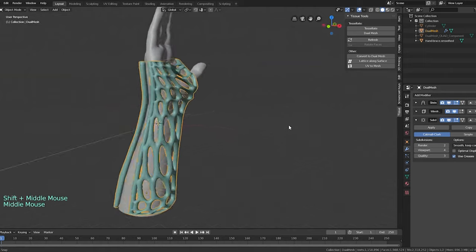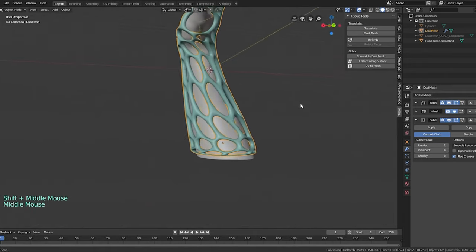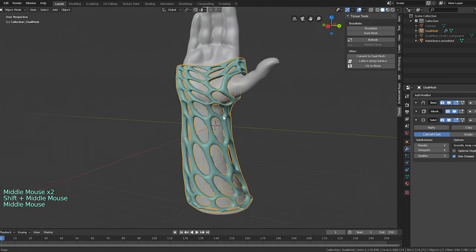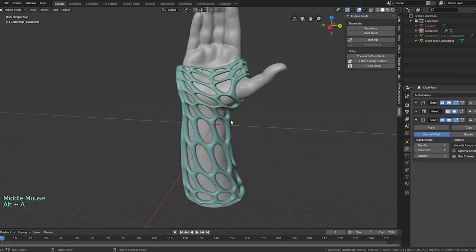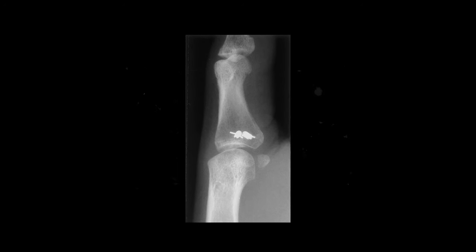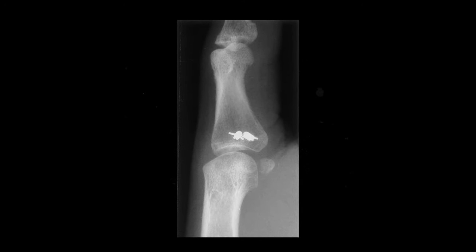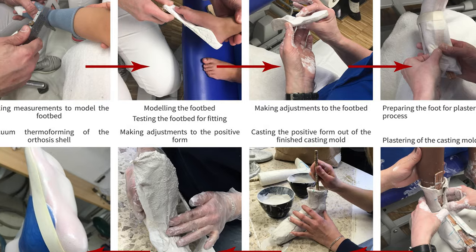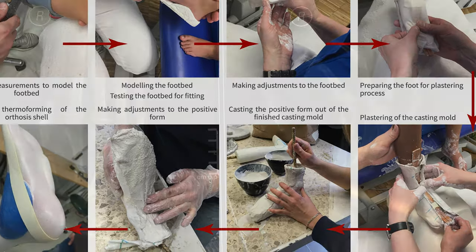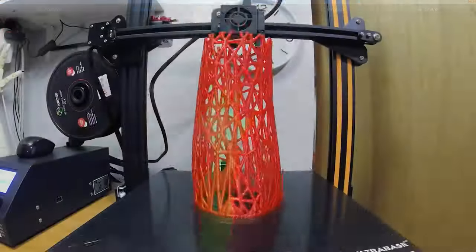As is evident, there are many opportunities for improving this technology, and the pioneers of 3D printing saw the potential of additive manufacturing to solve such emerging problems. The first 3D printed orthoses were introduced in 2013. At the time, the orthosis production scheme became clearer. The scheme comprises three main stages: X-raying, 3D scanning, and finally 3D printing.